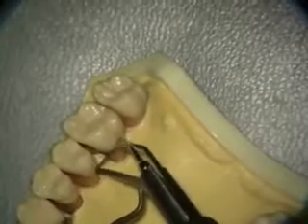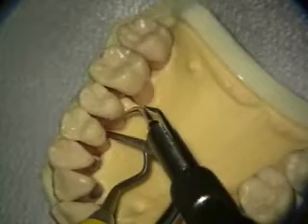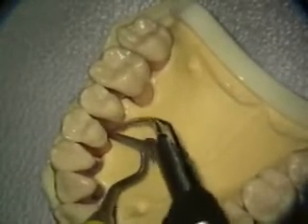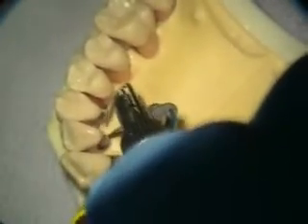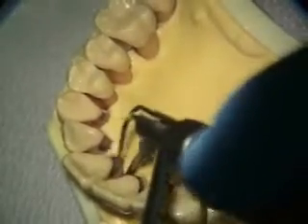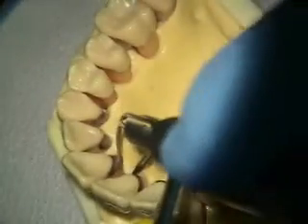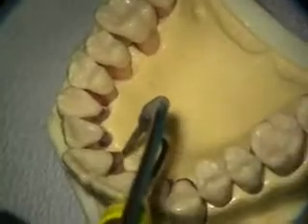Then go into the distal here, the distal of the premolar. Try to get as far to the facial as possible. The distal of the cuspid, the distal here, and then the palatal, distal here and palatal. And if the patient's having a problem with the water flow, then you may need to just do this when you get to the other side.